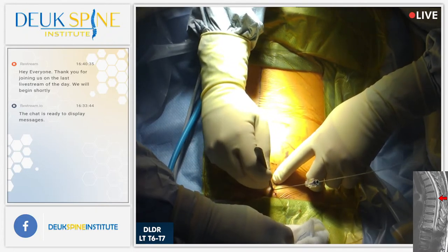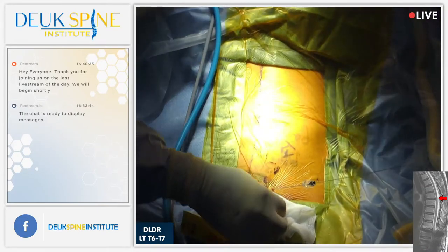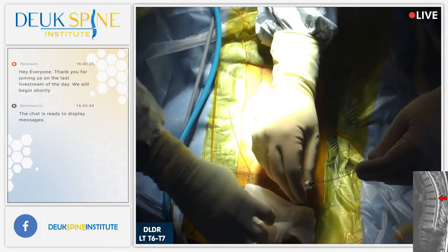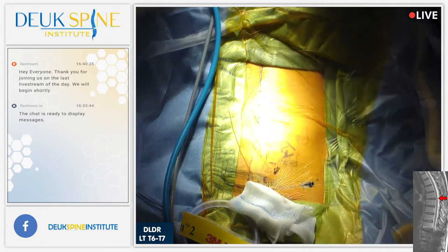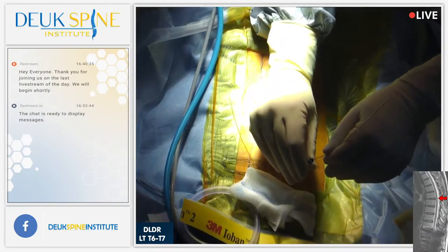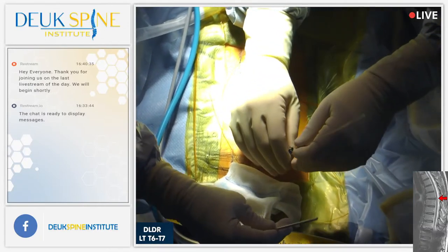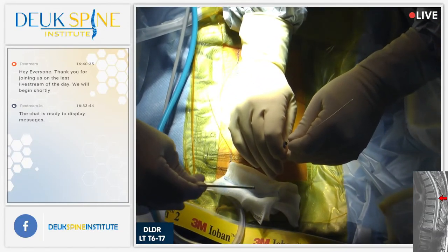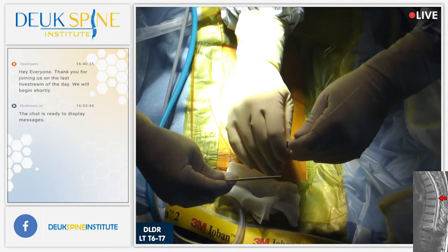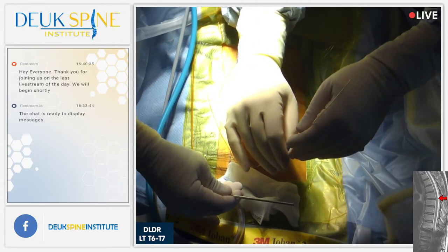All right, make an incision. That's a 4-millimeter incision. We're going to fix this entire disc herniation with that tiny little cut. X-ray shot. There's the guide wire, you can see it sitting in the disc. I'm going to pull this needle out. It's really tight. Shot.